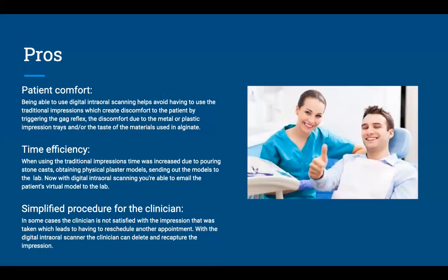But when you're scanning, you scan the patient to completeness and then you're able to send the file right away to the dental laboratory or to other providers if you're doing something else. While you're in contact with whoever you're sending it to, they can tell you if it is sufficient enough and accurate to continue with the treatment. If not, the patient's already there in the chair. You don't have to schedule a second appointment, and it saves the office time, the dental laboratory, and the patient. So it's a win-win for all.